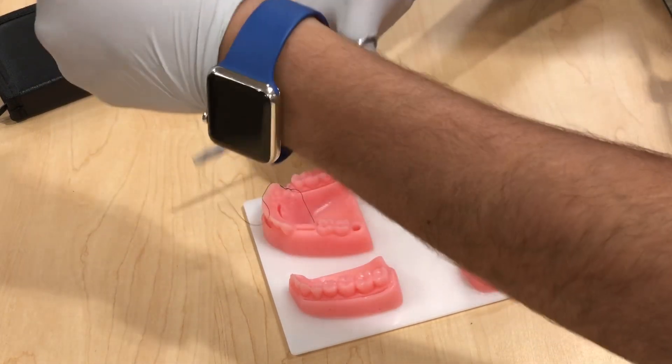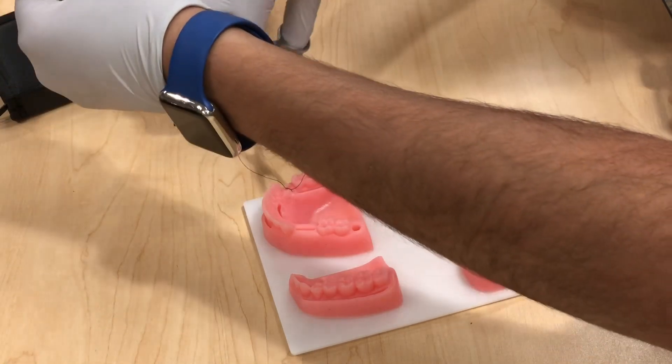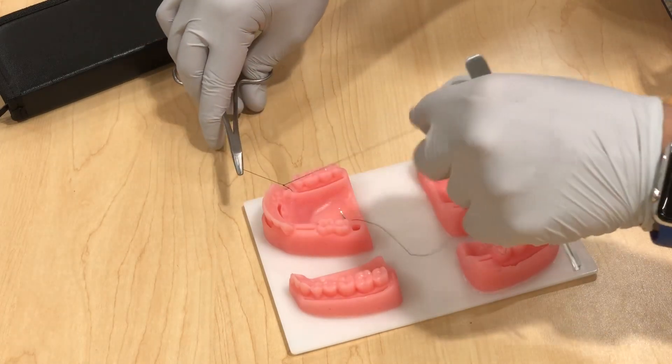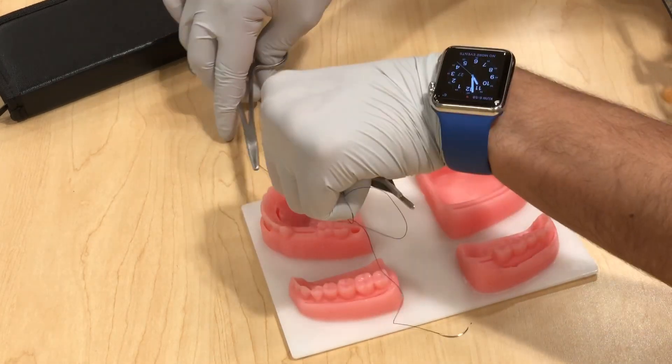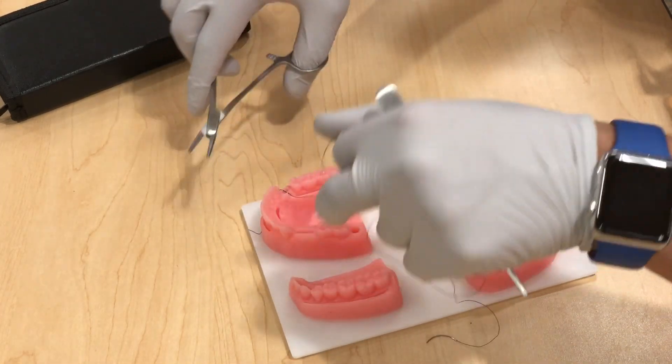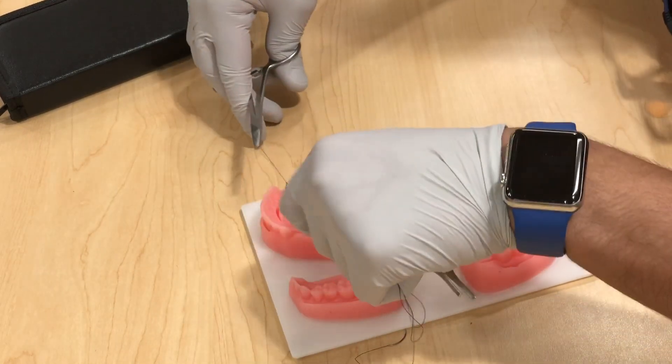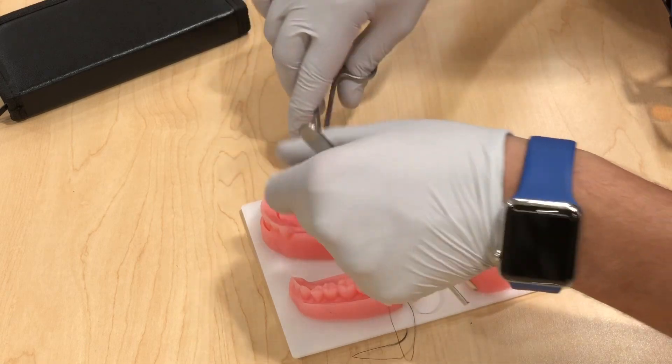Then do one loop toward the short tail, grasp the tip of the tail, and tighten in the opposite direction. Then do one final loop toward the short tail, and there you go.